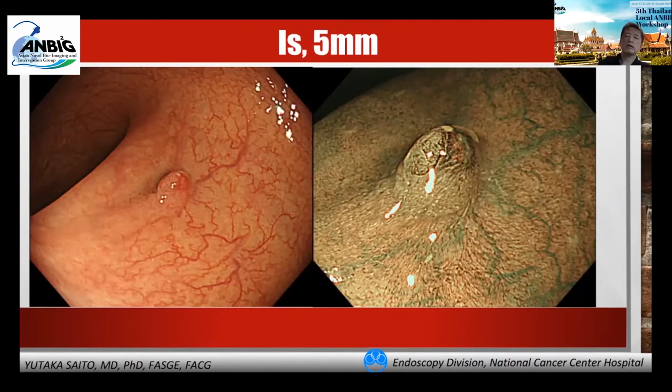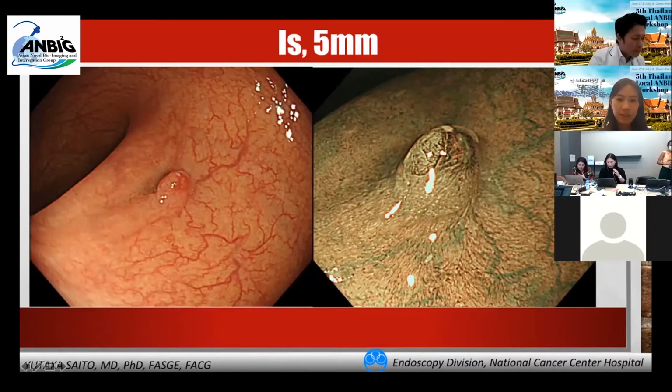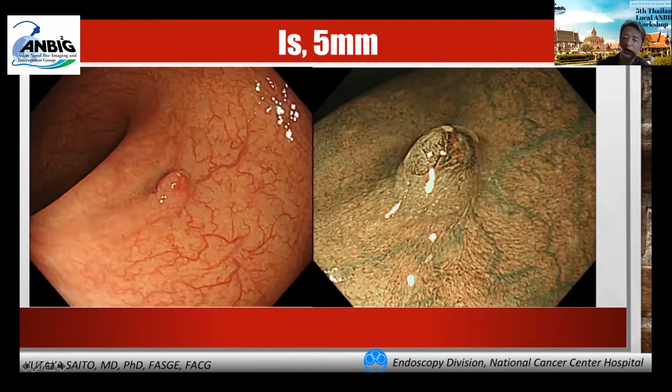How about this lesion? A small one. This is a case at our National Cancer Center. A red polyp, and if you look carefully, there is some stretching of the fold. Could you observe it? In the NBI there are differences. The top of this small, tiny polyp shows some brownish vessel pattern, and the right side and left side are different. The lower part could be normal mucosa. So this could be some SMT-like elevation with some fold stretching, if you look carefully.